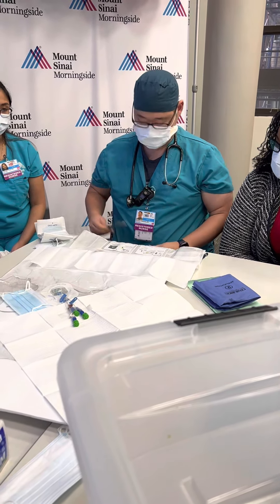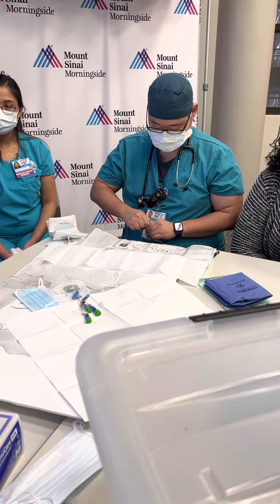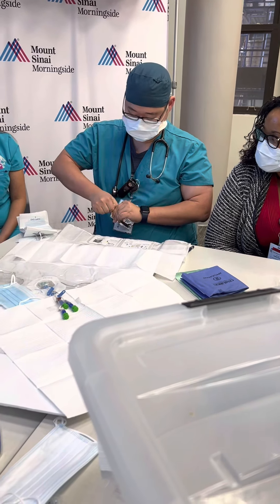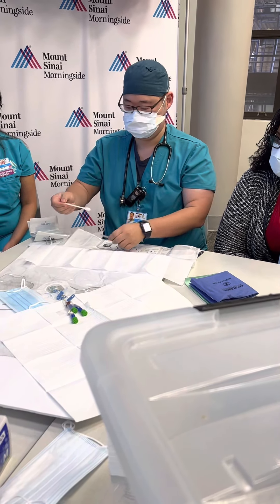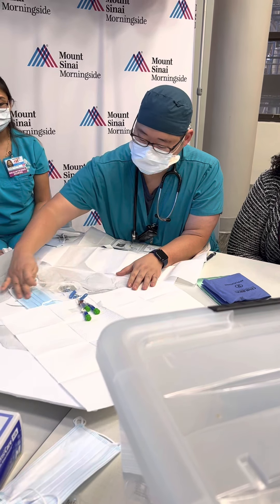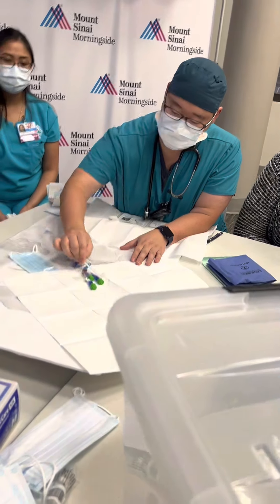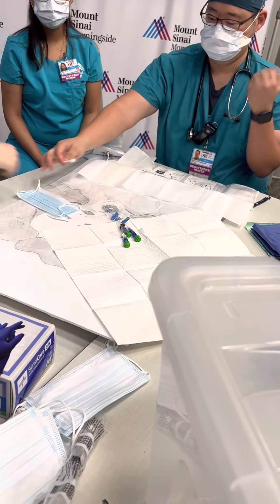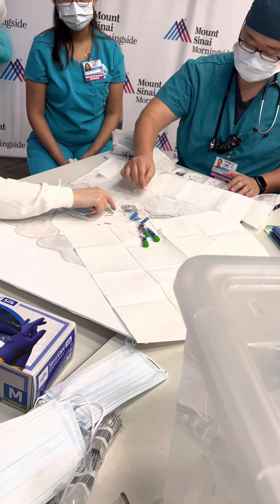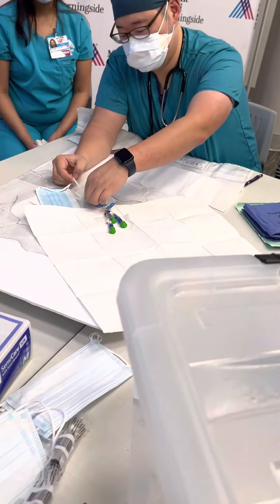You don't need to shake it — this is just an alcohol swab. Whenever you take off any kind of dressing from a patient, scrub with alcohol wipes just to loosen up the adhesive and make sure the overall area is clean. Try to really get the edges off, because that's where patients will feel the pain.